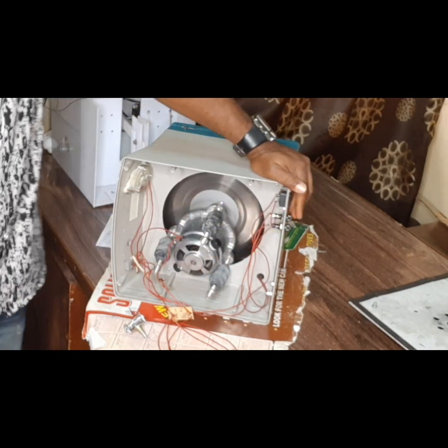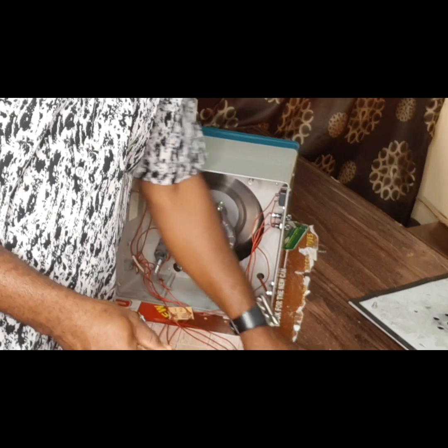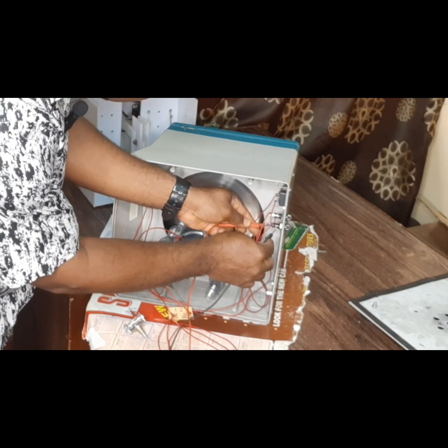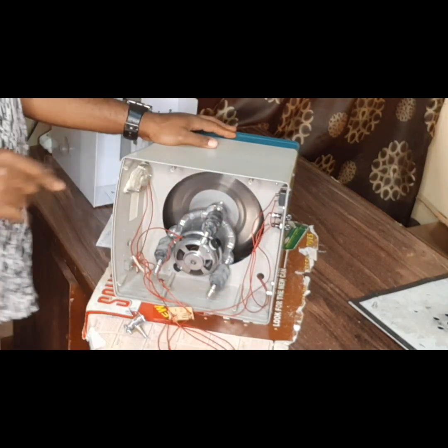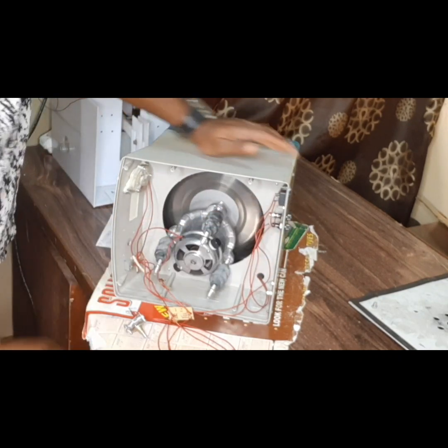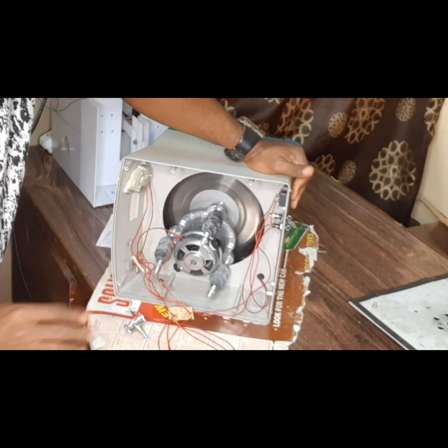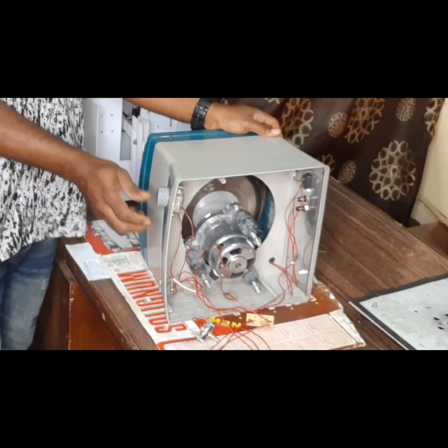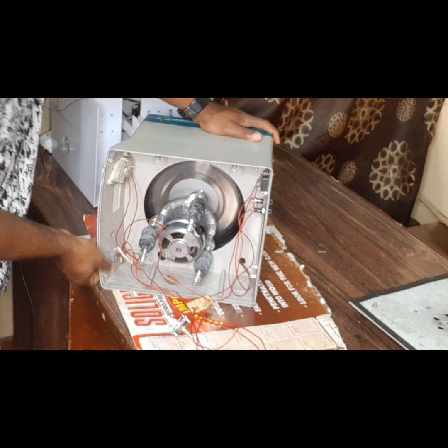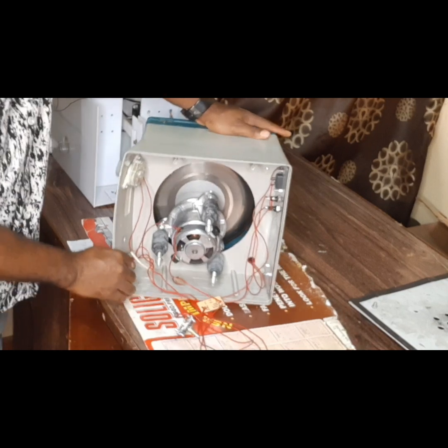Internally, you can see the fuse. We've been able to use our digital meter to confirm the status of the fuse. You can see that by testing the two fuses, they're all okay. So we have confirmed that this fuse is okay, then the outlet for the supply cord is okay. Then here we have the timer. We've confirmed that the timer is okay as well. Then you have the control knob here, the on and off switch. The switch is okay as well.